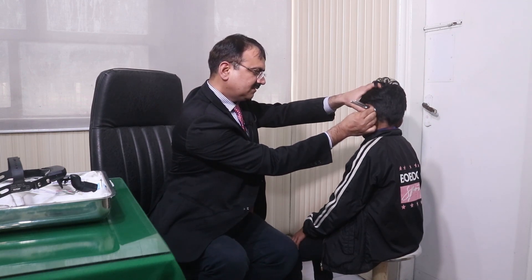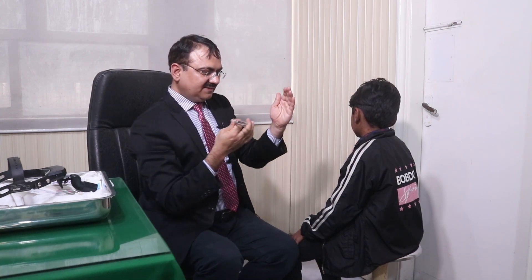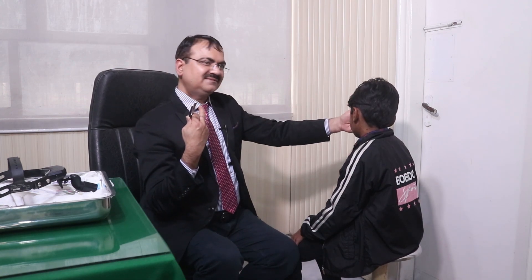Now the sound is gone. So for the left ear, we do it similarly, then move to the right ear. When I perform the test on his right ear, I will then do my left ear. You have to compare both ears.